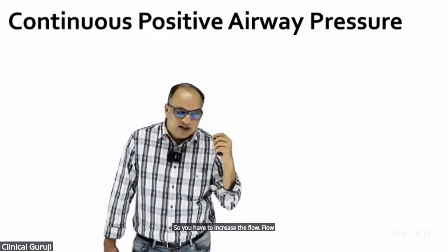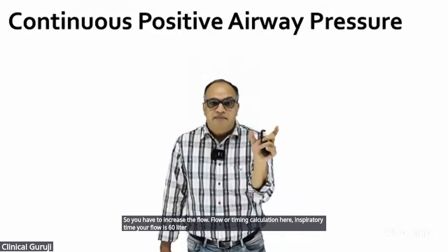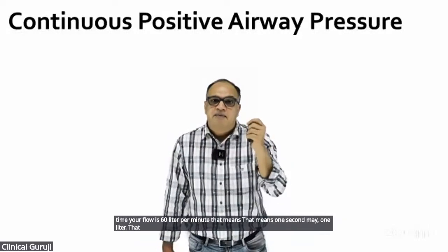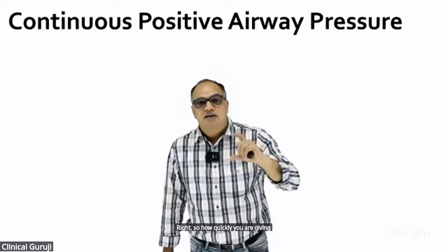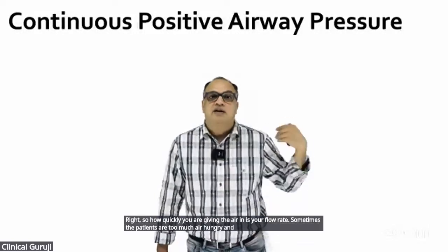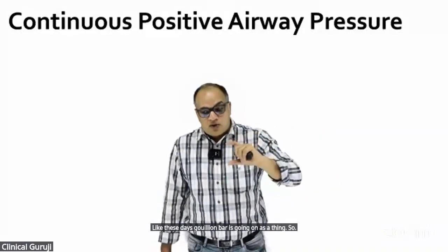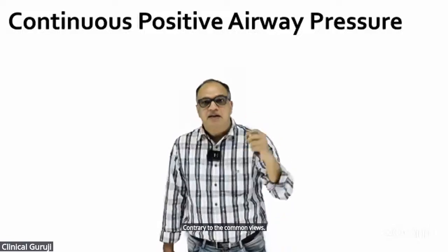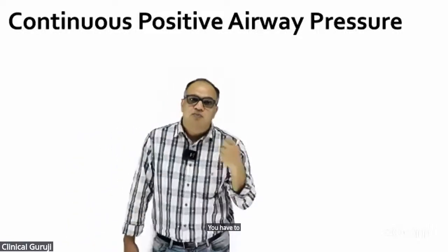What is the relation between flow and timing of inspiratory time? Your flow is 60 liters per minute. That means 1 liter in 1 second. That means 500 ml in half a second. Right? So how quickly you are giving the air in is your flow rate. Sometimes the patients are too much air hungry and they want it very quickly. Like these days, Guillain-Barré is going on as a thing. So in Guillain-Barré, you need to have more inspiratory time, contrary to the common views. Similarly, whenever a patient is air hungry, you have to increase the flows most of the times.